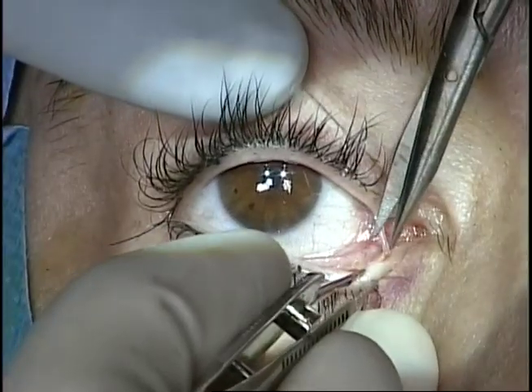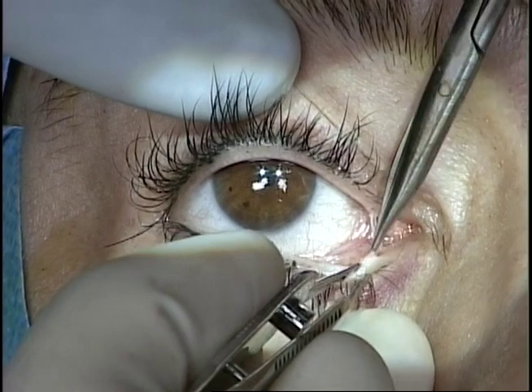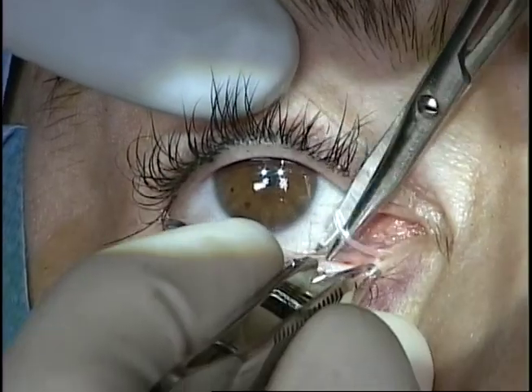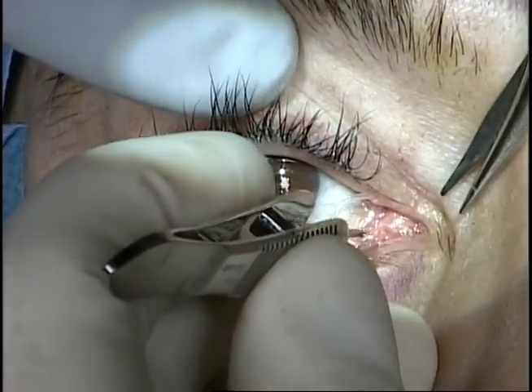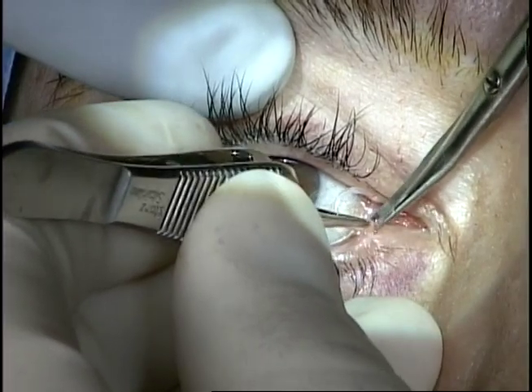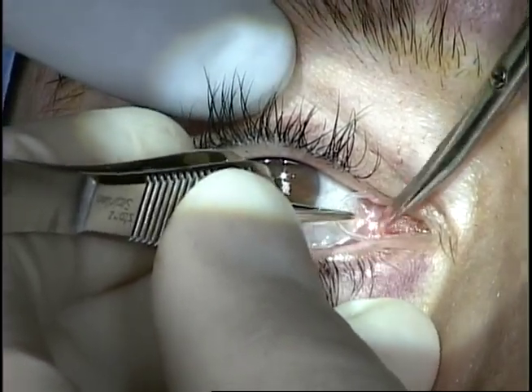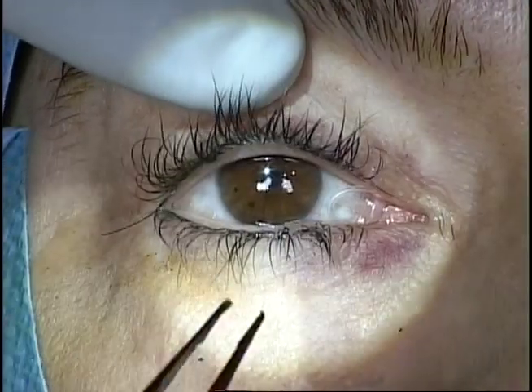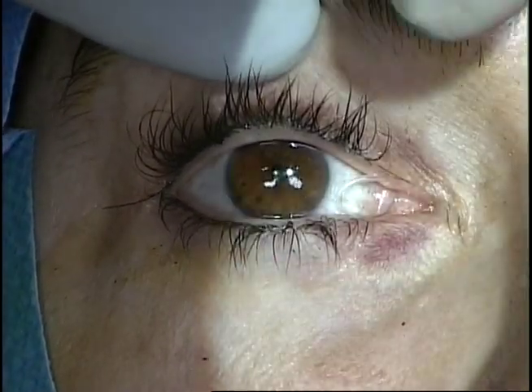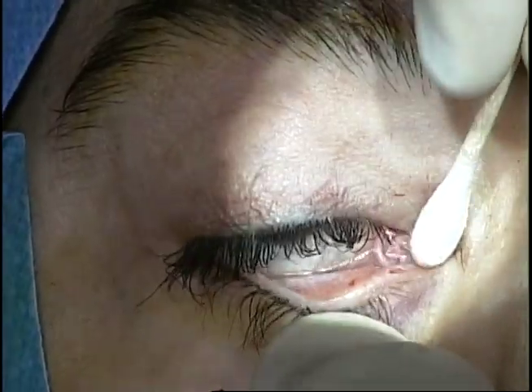The punctoplasty is then performed. This is a two-snip punctoplasty: a vertical snip is performed with Westcott scissors followed by a diagonal snip to remove the posterior portion of the vertical portion of the canaliculus. This is performed only on the lower lid. The upper punctum remains intact to prevent postoperative cheese wiring by the stent.